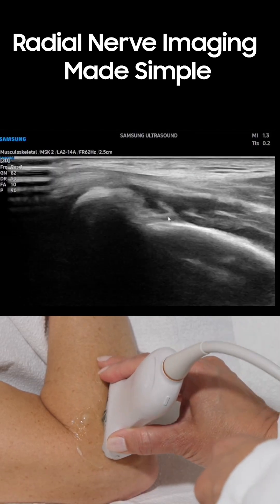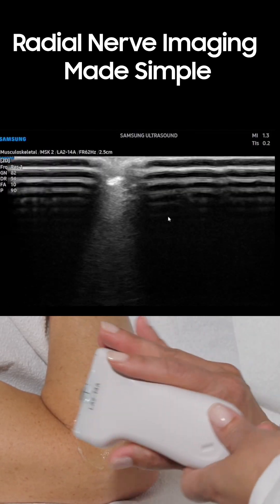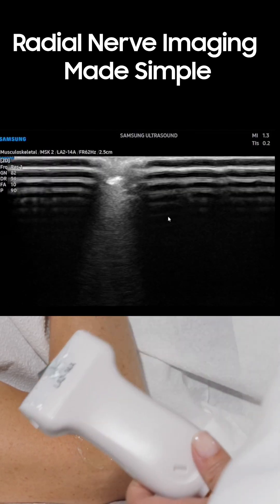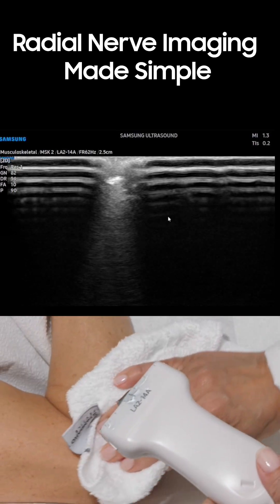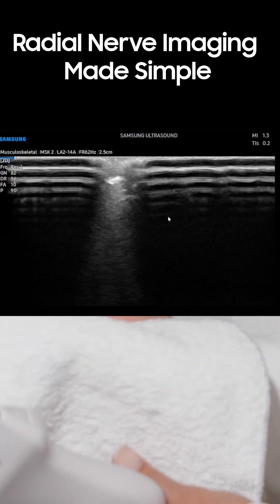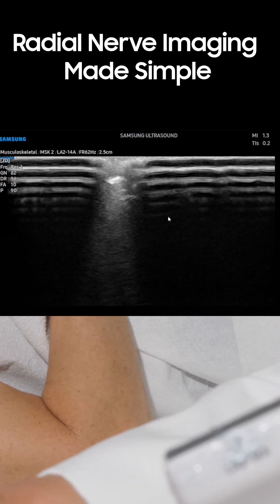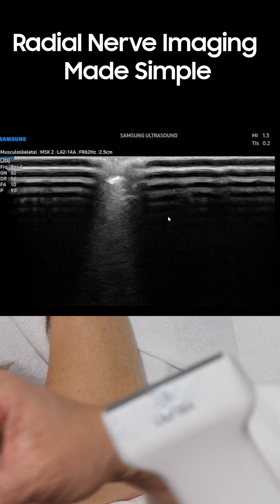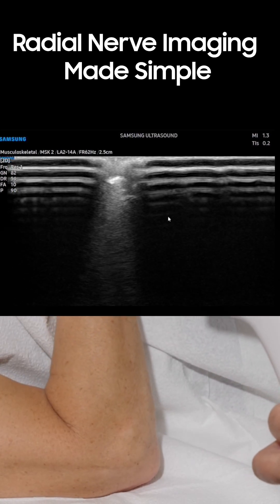Even though I showed earlier the radial nerve can be seen in the anterior portion of the elbow, I include that as a component of my lateral elbow examination.